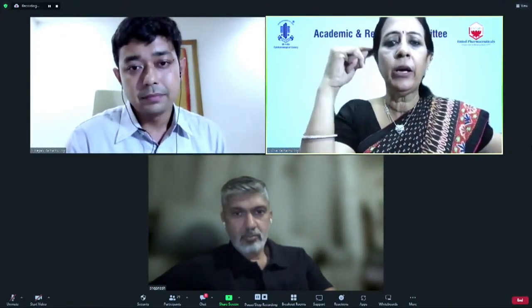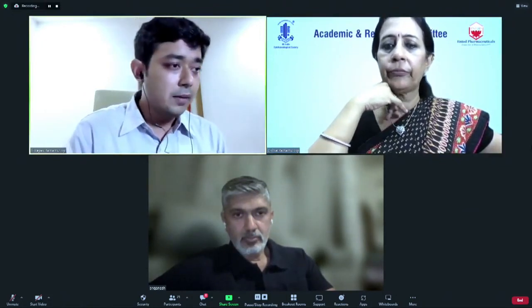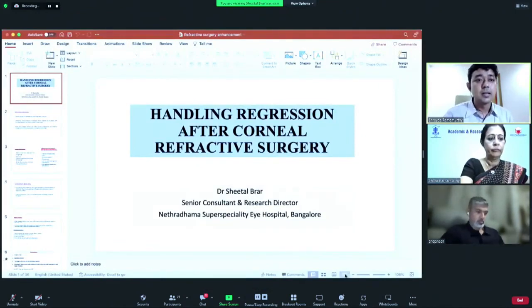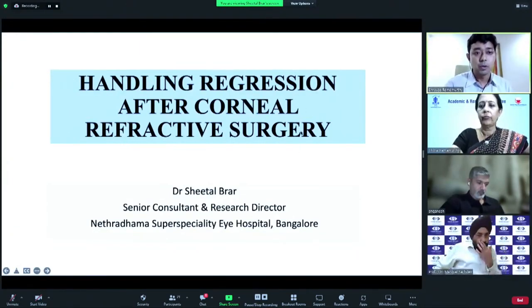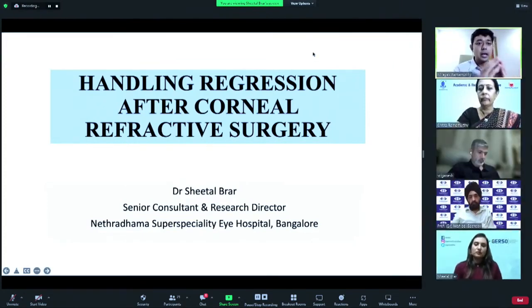How have we modified our INTACs case selection with time, with experience? What do we do now? So I think, in many practices, the number of intracorneal ring segments which was being done, let's say 6 or 7 years ago to now, has probably come down a little bit because our case selection has improved, and we know where topography guided PRK works. We were probably not doing as many topography guided PRKs a decade ago as we are now. And the case selection, understanding, follow-up outcomes of that has improved.